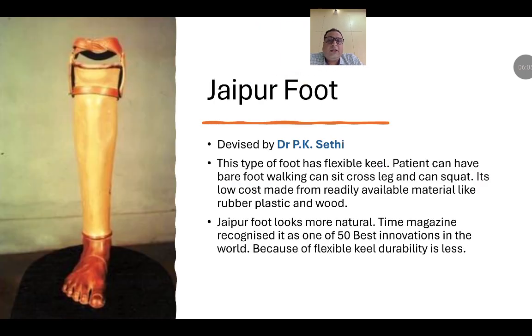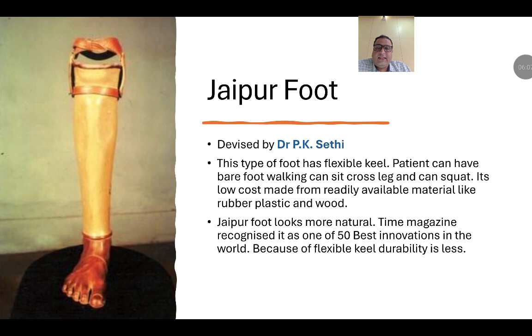Now we will discuss the Jaipur foot. It is devised by Dr. P.K. Sethi from Jaipur. So this type of foot has a flexible keel. Patient can have barefoot walking, can sit cross-legged and can squat. This is low cost, made from readily available material like rubber and plastic and wood. Jaipur foot looks more natural. Time magazine has recognized it as one of the 50 best innovations in the world. Because of the flexibility of the keel, it is less durable.